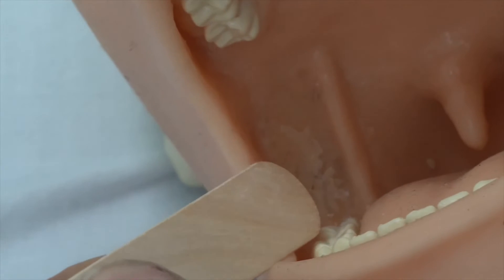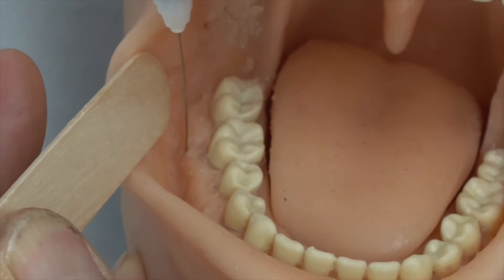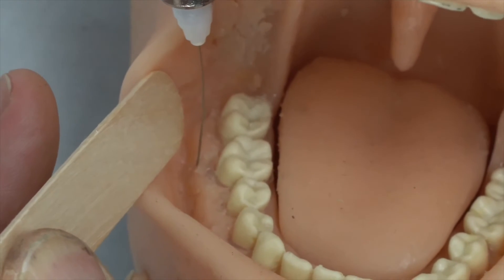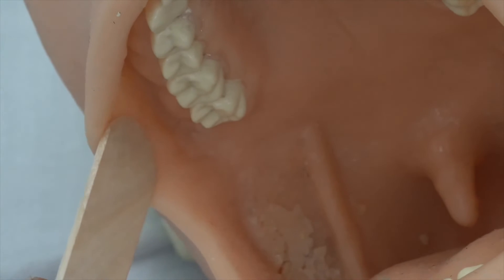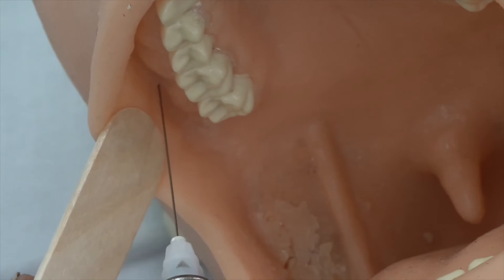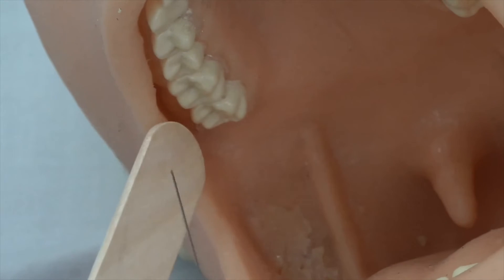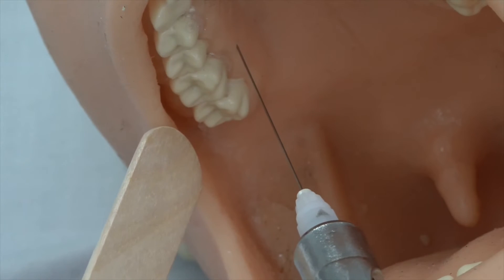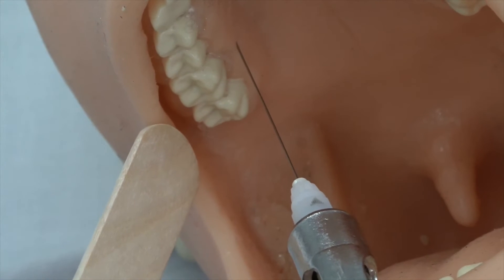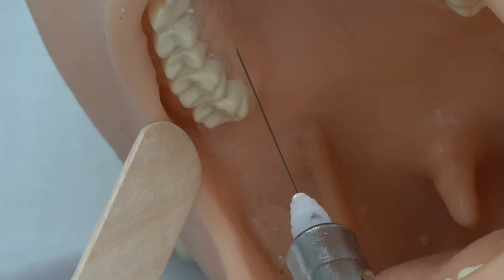The nerve block can be beefed up by injecting two or three mils into the buccal sulcus on the upper gum. A dry socket on an upper molar can be managed with a field block. Inject one to two mils into the sulcus, then in the second injection advance the needle just one or two millimetres under the mucosal surface on the palatal side and inject a small amount of local anaesthetic to blanch the skin. This is quite a painful injection.